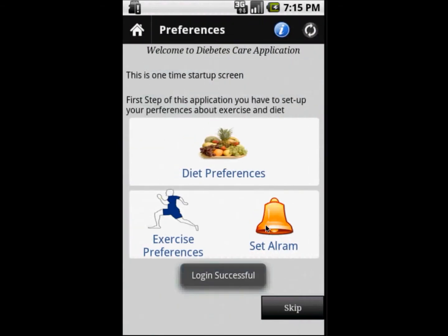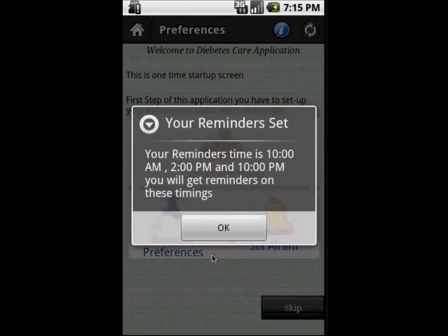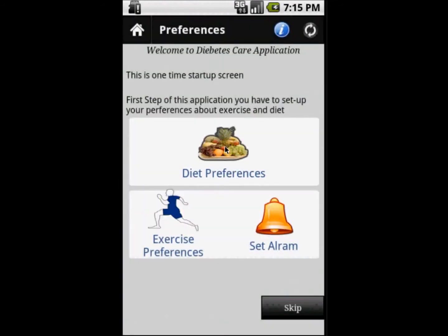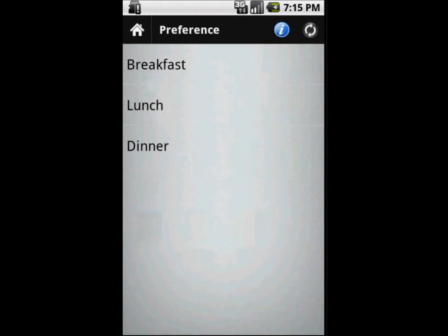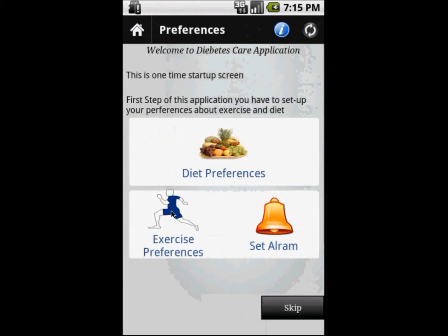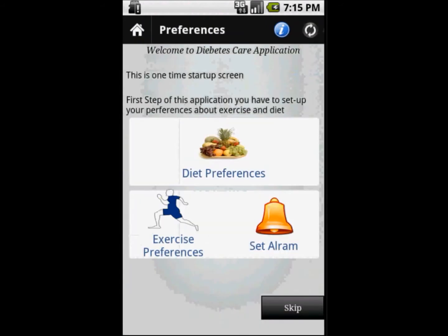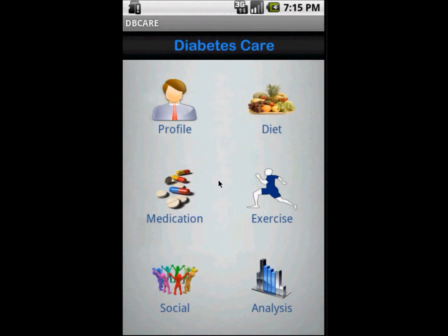Here we can set preferences — reminder preferences for what time we will get reminders, food preferences for what food should be shown first in the food list, and what exercises should be suggested by the application.